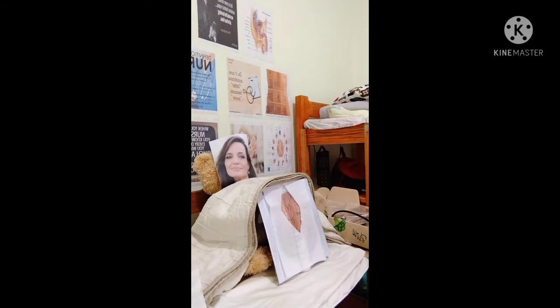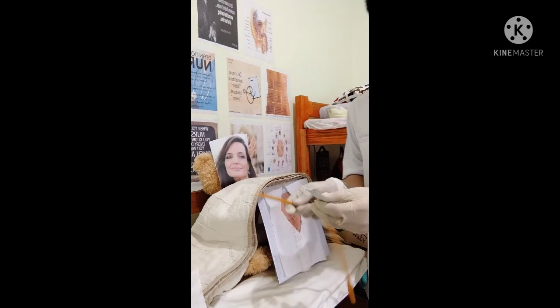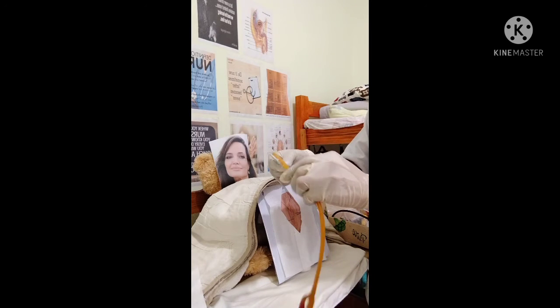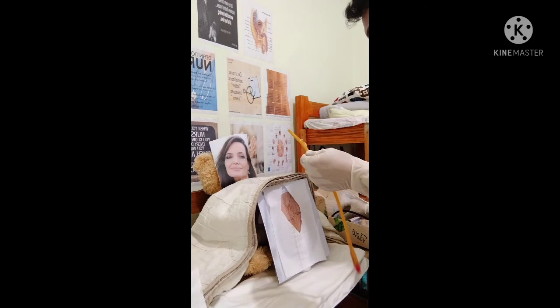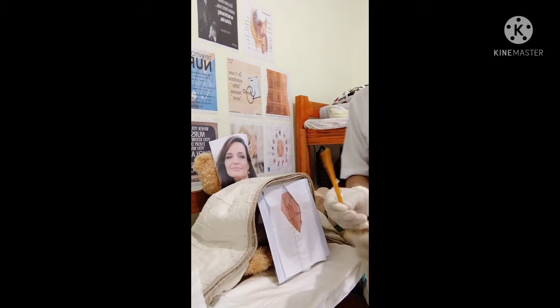So after putting the eye sheet, now we need to lubricate the catheter. We need to lubricate the catheter at least about 1 and 1/2 inches, being careful not to plug the eye of the catheter. So this is actually done to reduce the friction and possible irritation as the catheter is inserted.